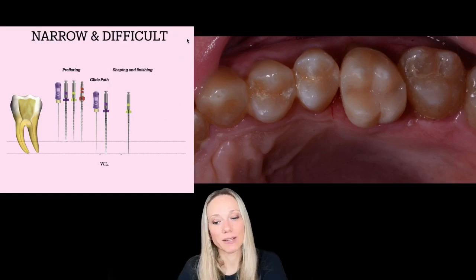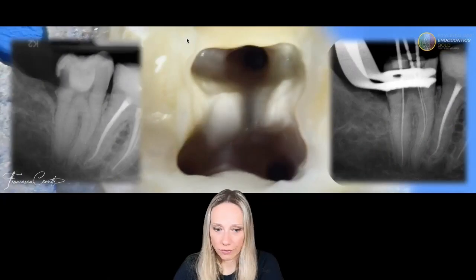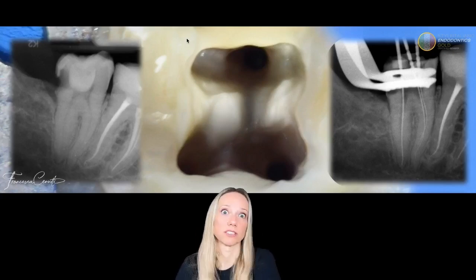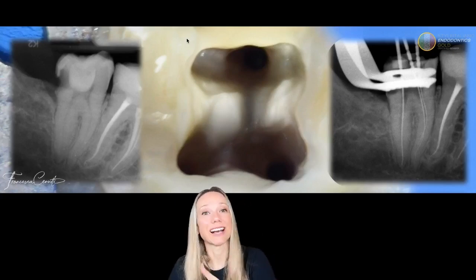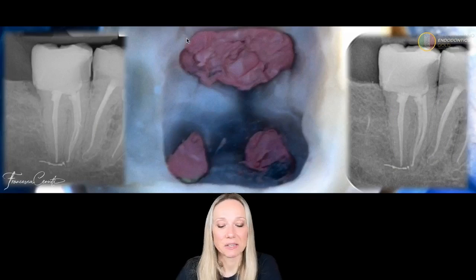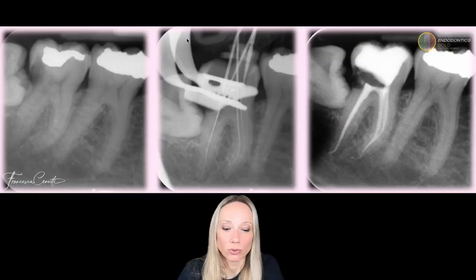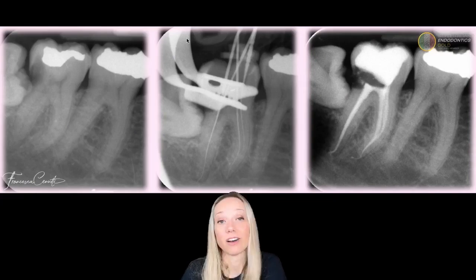But in very complex cases, in general, you just stop at the 20 or the 25. This is another situation, double curvature in the major roots. The tooth is not easy because it's a second lower molar, so also the access is not easy. But then I follow the same protocol and I achieve the same result. So there is a repeatability of what you do.